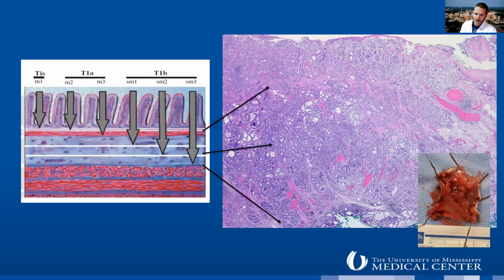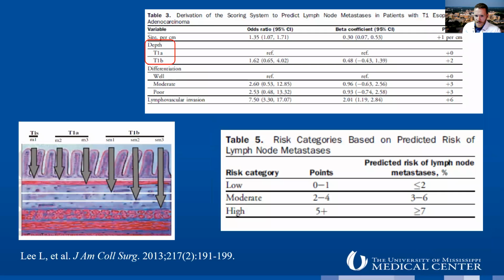So this is that patient's final pathology, and as you can see, there's tumor invading through that top line, the muscularis mucosa, the whole submucosa there. You see all of those crowded and atypical, kind of misarranged nucleoli, all the way down to the very deepest part of the submucosa. So this was a tumor that was deeply invasive, and is going to require either an esophagectomy or definitive chemoradiotherapy, depending on the patient and the remainder of the assessment.